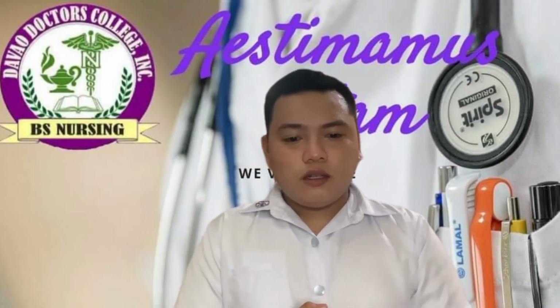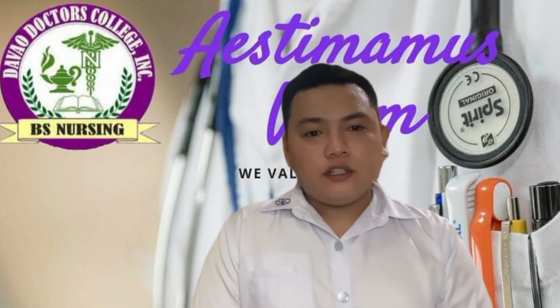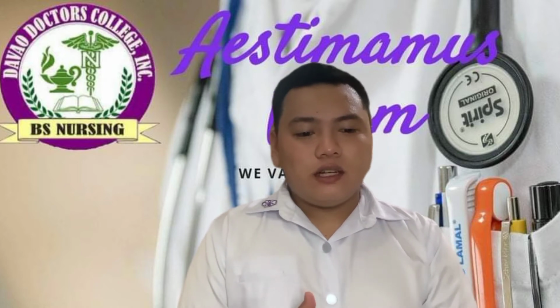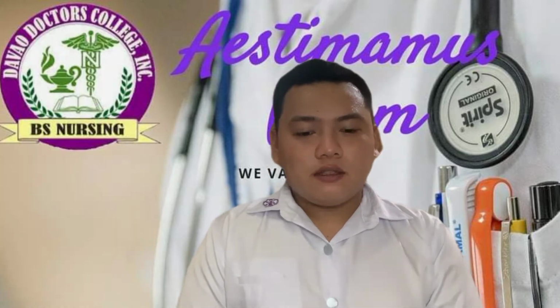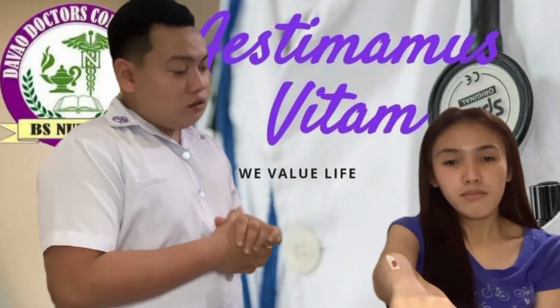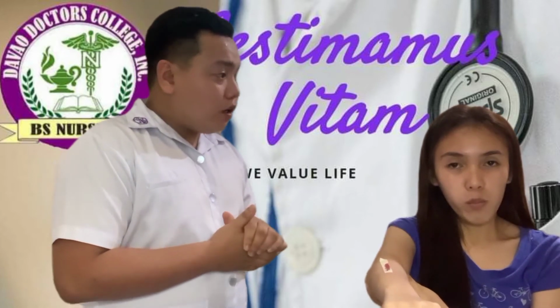So, next step is you will need to get a consent. Rationale for this, it is important to get consent from the patient because patients have the right to make informed decisions about their care and treatment. Today, ma'am, I am Gamposilao, student nurse and also first aider. May I help you, ma'am?